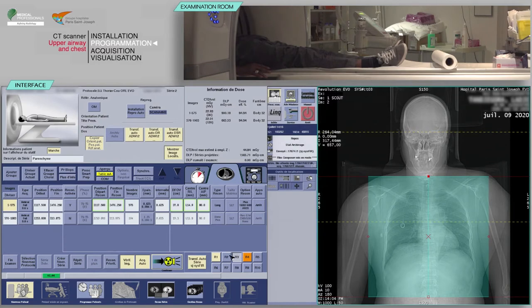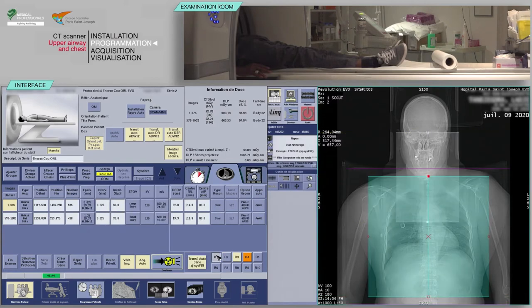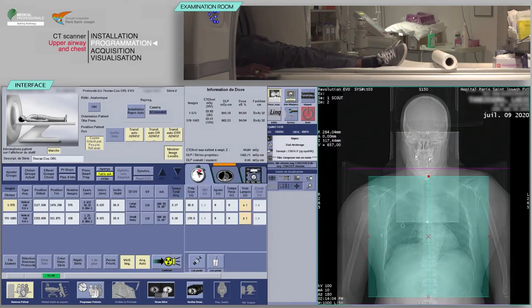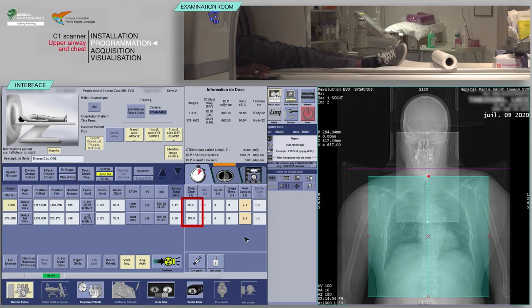For the upper airway scan, a smooth reconstruction will be required to study the different parenchyma enhancement. As indicated earlier, reconstruction with a sharper filter and bone windows may be required on this region. Next, check the programmed scan delays. The chest is examined at standard arterial time with a delay of 30 seconds. The neck is explored in the double injection phase.